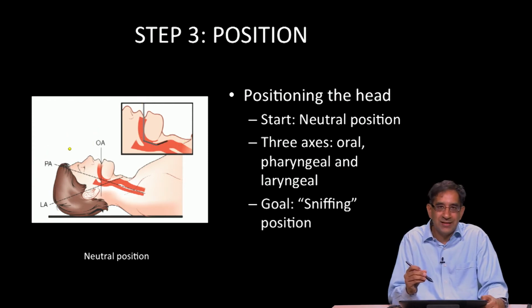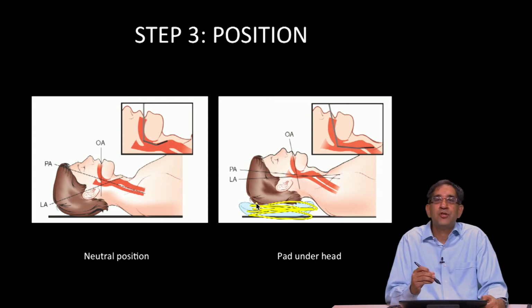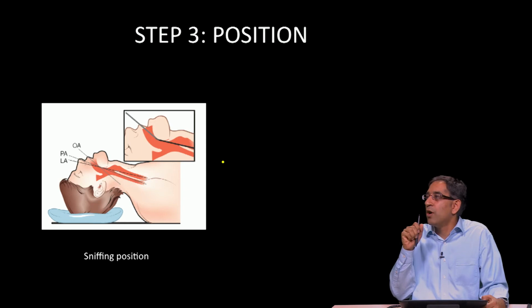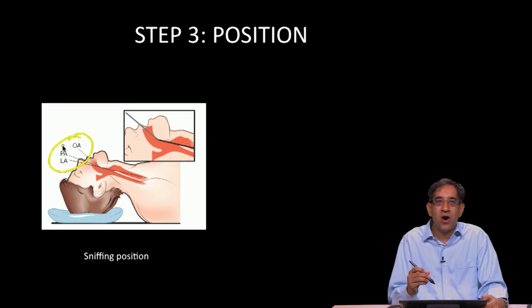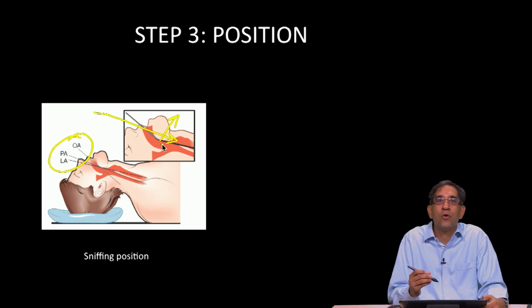The goal is to get the patient in the sniffing position. So let me show you how you do that. The first step in an adult, as I mentioned, is to put a pad or a towel underneath the patient's head. And by doing that, you're going to align the pharyngeal and laryngeal axes. The next step is to get the patient in the sniffing position. As you can see here, it's almost a position of sniffing a rose, okay? So you're going to be flexed at the lower neck and extended at the upper neck. And now what you see is all 3 axes are more aligned, and if you can just get your laryngoscope blade into the mouth and lift up, you're going to be able to see the vocal cords and pass the endotracheal tube.